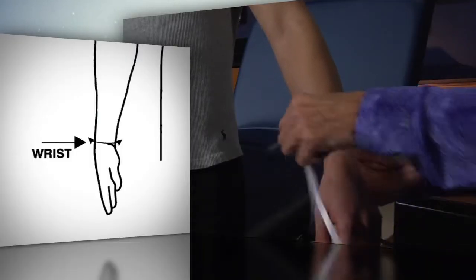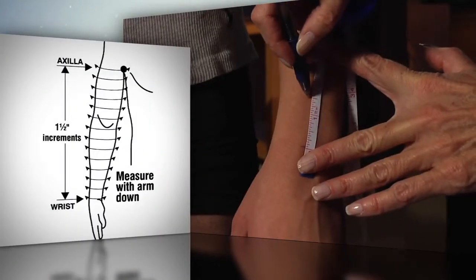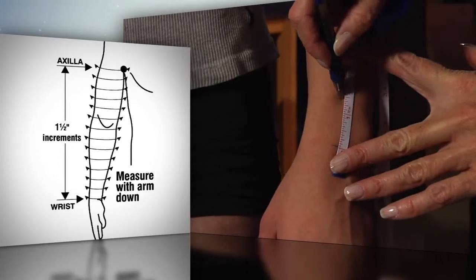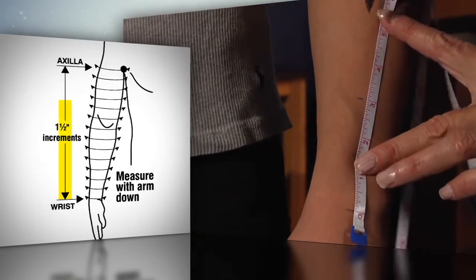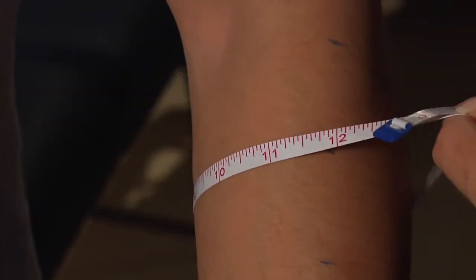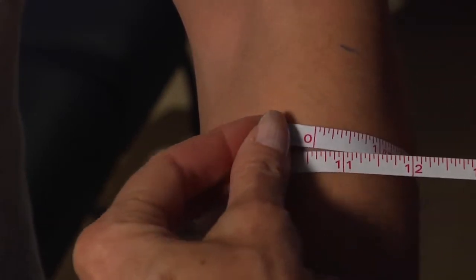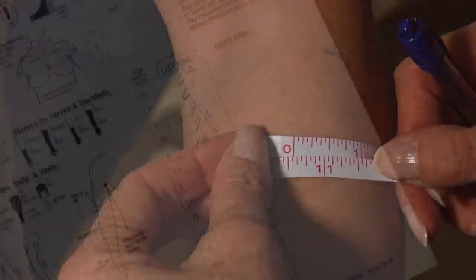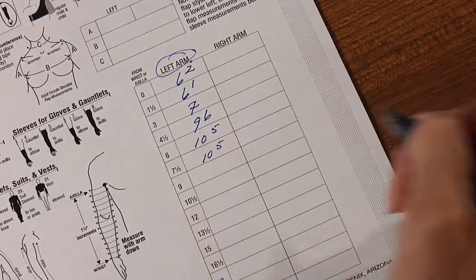In this example, we will start from the wrist, measuring the circumference of the wrist. From there, make a mark on the patient with a pen every one and a half inches from where the sleeve will begin to where the sleeve will end. Use the retractable tape measure or wide tape measure to measure the circumference of the arm at each mark, recording the measurements on the BioConcepts upper extremity measurement chart.